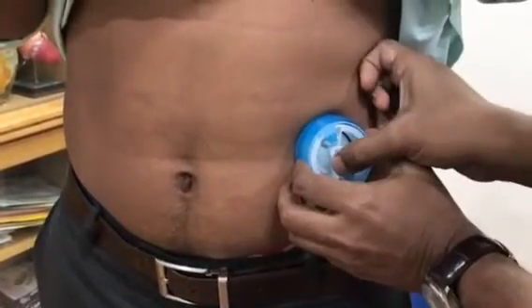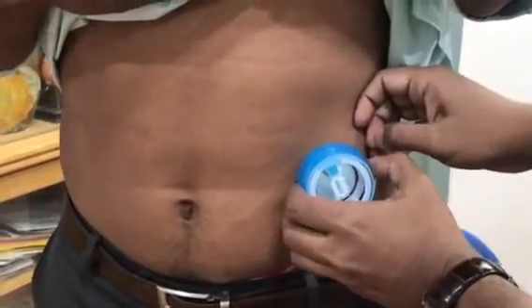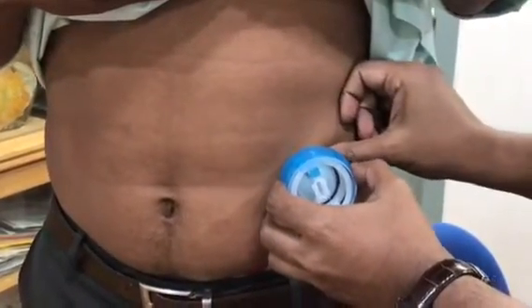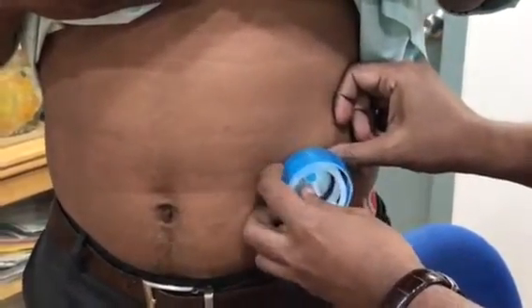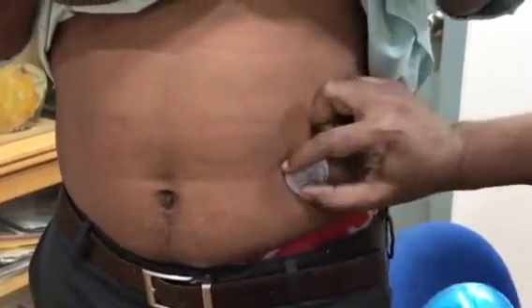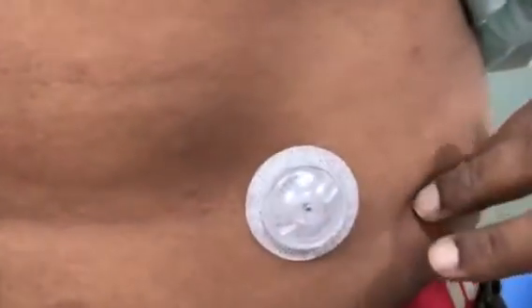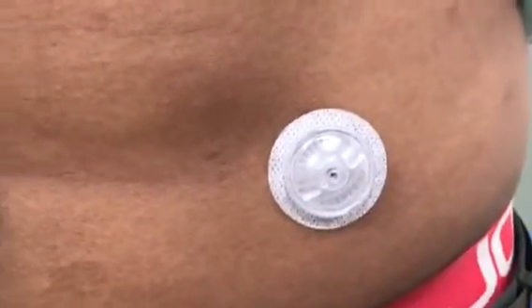I am going to squeeze these two simultaneously and then press this part. Whichever injections you are currently on — rapid and long-acting — you can have both injections right here. Can you see the central part? This area is what we call the septum, and I will demonstrate an injection over here.